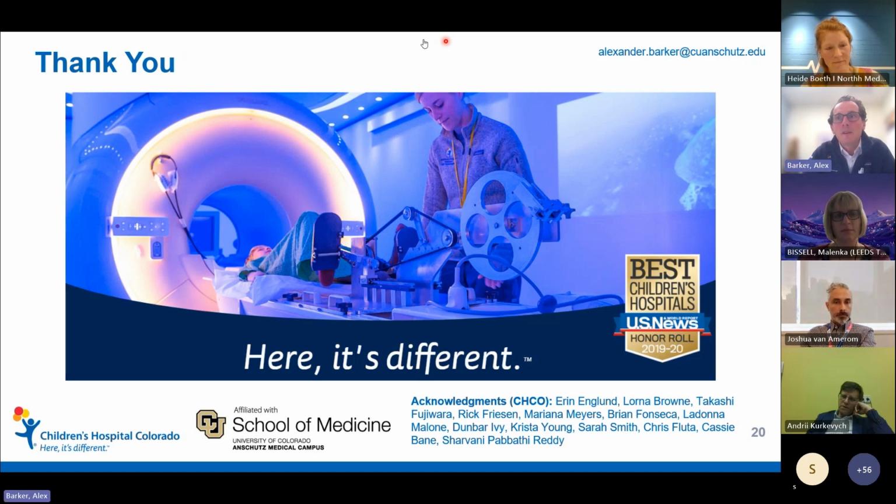I would venture to say in 80% of our cases, we get the short axis stacks. Now, our center may be a bit luckier. I don't know. We also are very careful about the timing of our acquisition so that we don't wake up the baby when we get these stacks. But once you start doing the cine stacks with breath holds, you're going to wake the baby up. It'll be interesting to see what other centers' experiences are. I would say 75 to 80% of the time we get the short axis stack. But it's a challenge. We do need to reacquire sometimes.